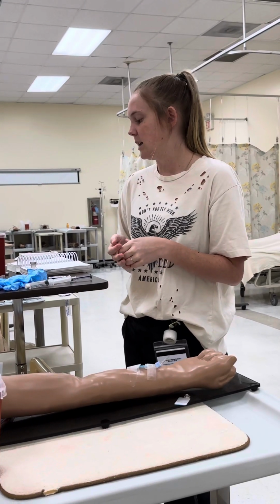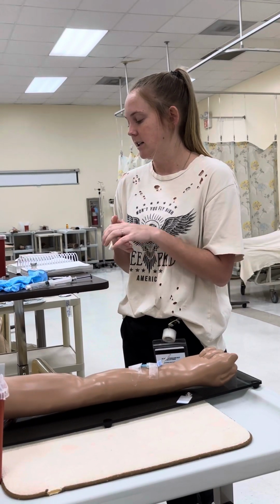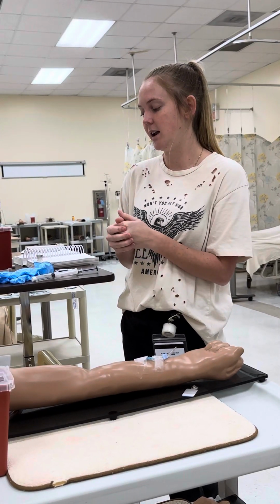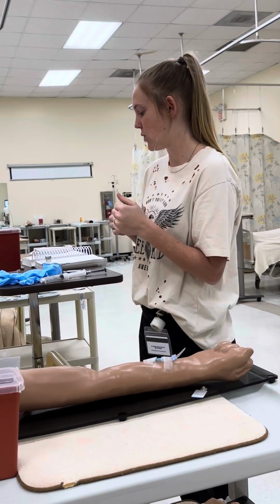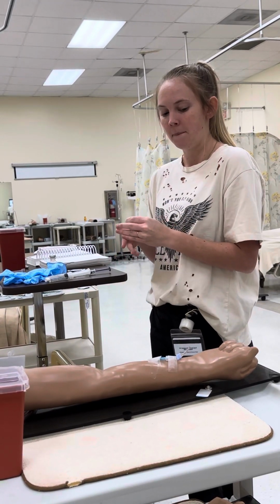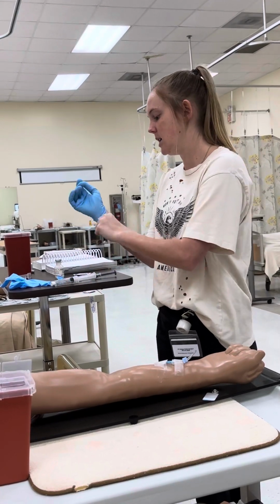And I will then explain to them the procedure, that I'm going to be giving them their IV medications and letting them know to let me know if they have any discomfort at the site of their IV, or if they are having any dizziness or nausea when I'm injecting the medication, so that we know that they aren't having any adverse reactions. I'm going to perform hand hygiene and maintain an aseptic technique.